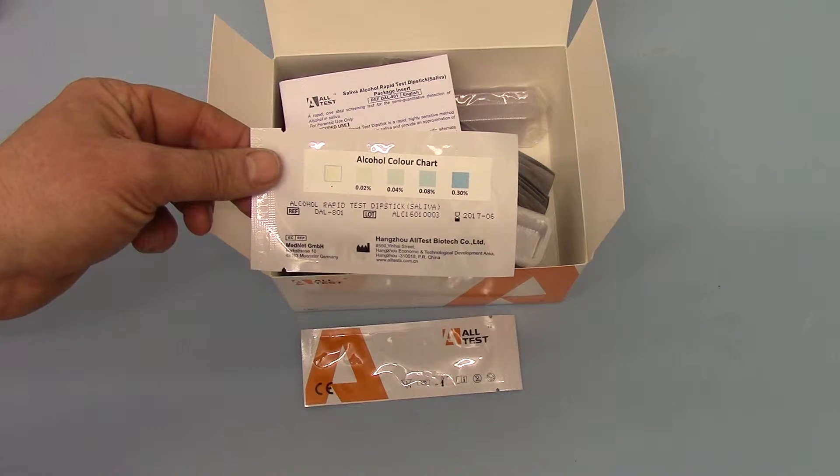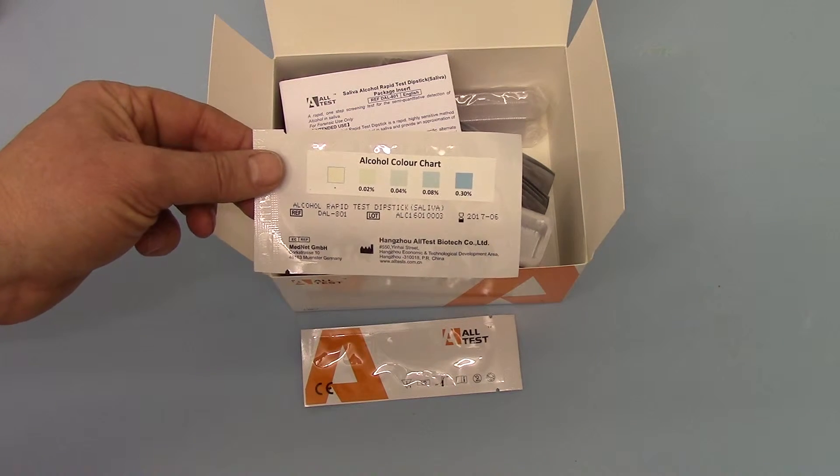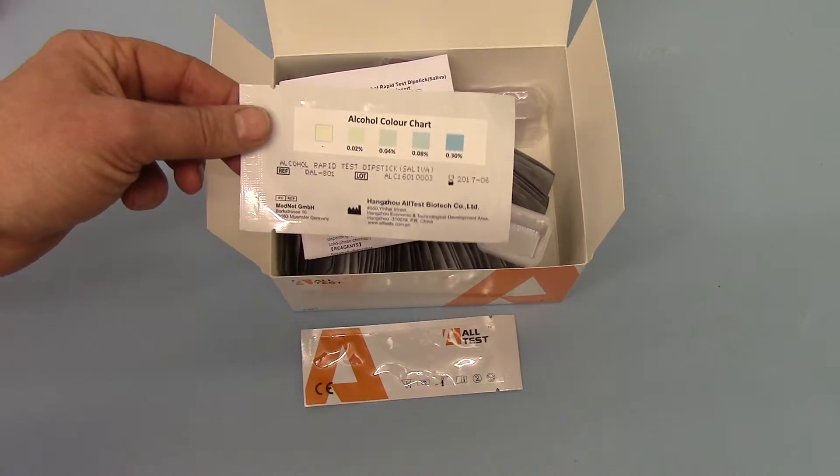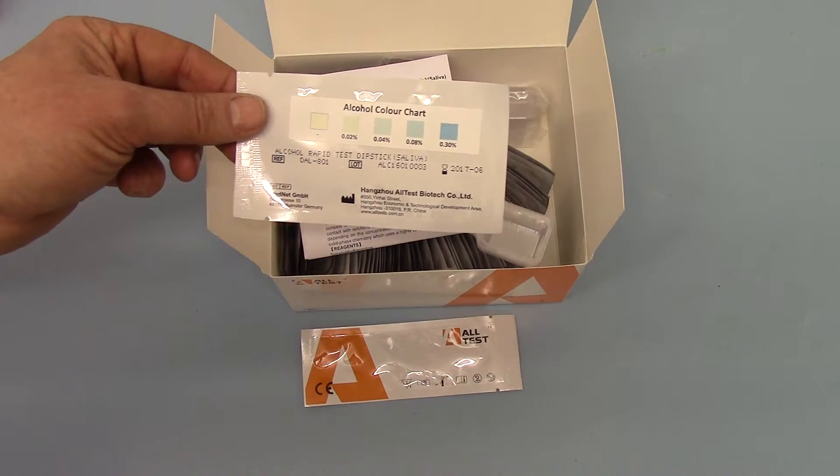However, that is non-specific in relationship to the concentration of alcohol — it's just an indicator of the presence of alcohol. So the colour chart can only be referenced when the test is performed on saliva.